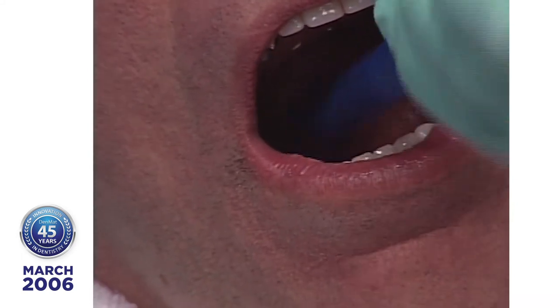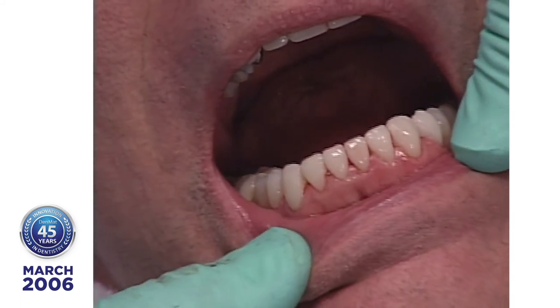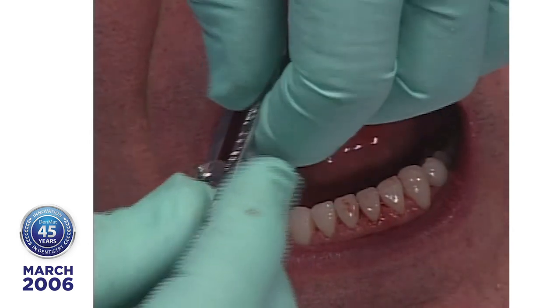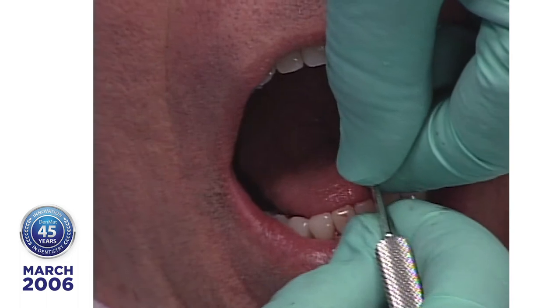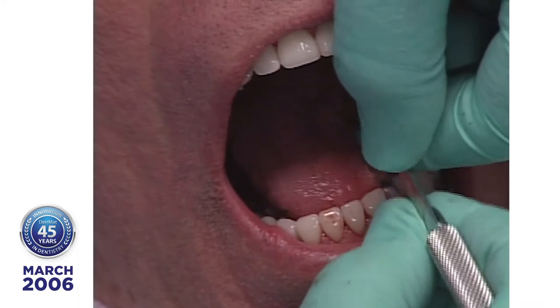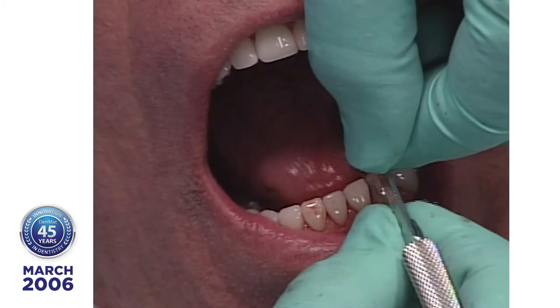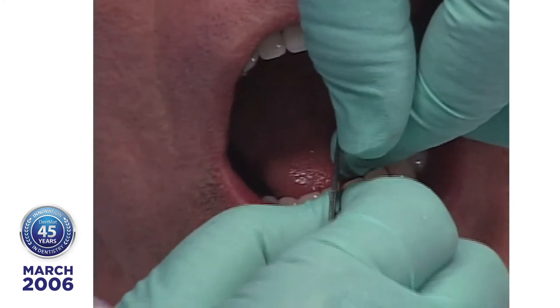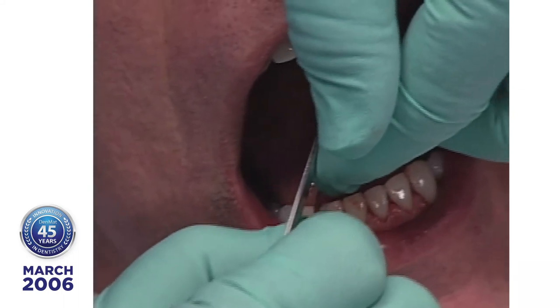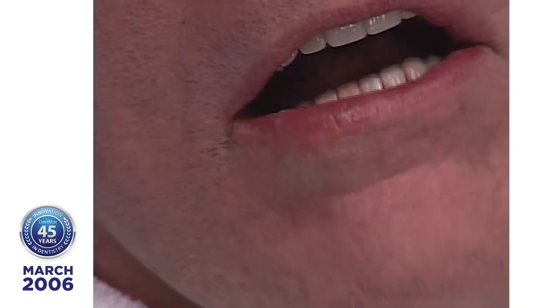All I did is that routine stuff of taking Ultrabond away and opening the contacts. Why don't you give me a Sof-Lex sander here, and I'll open this up a little bit. I haven't opened the contact right here on this cuspid or bicuspid because he's going to be back tomorrow. And these were a little tight getting out. So I don't want to put too much force on, especially on lowers, because they don't have so much area. It's pretty easy to pop them off or break them in the early stages. They have less surface area than maxillary centrals and all that.